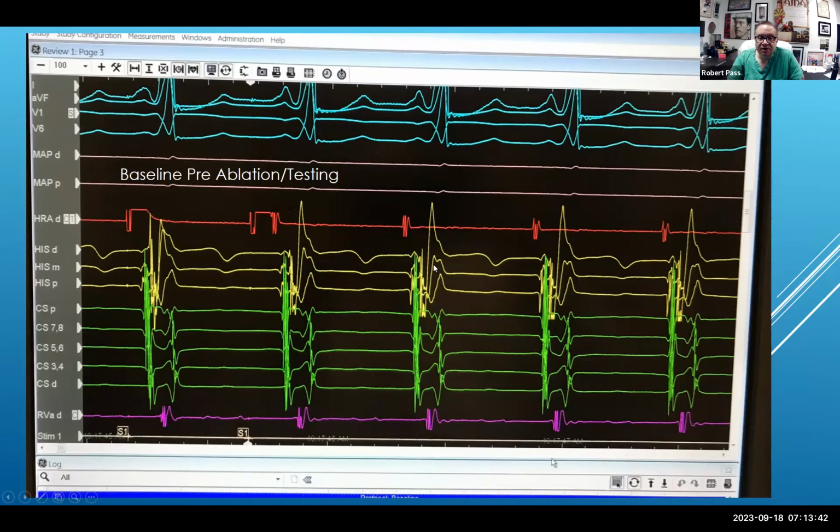So when you have a patient who has WPW and you see that the A, the His, and the V are all sort of squished together as they are here, that's a worrisome finding for the electrophysiologist because it means that the pre-excitation locally is so profound that you almost can't see a His there, because you are pre-exciting the ventricle prior to onset of the His bundle. And that is usually an indirect sign that the pathway is at least close to the bundle of His.